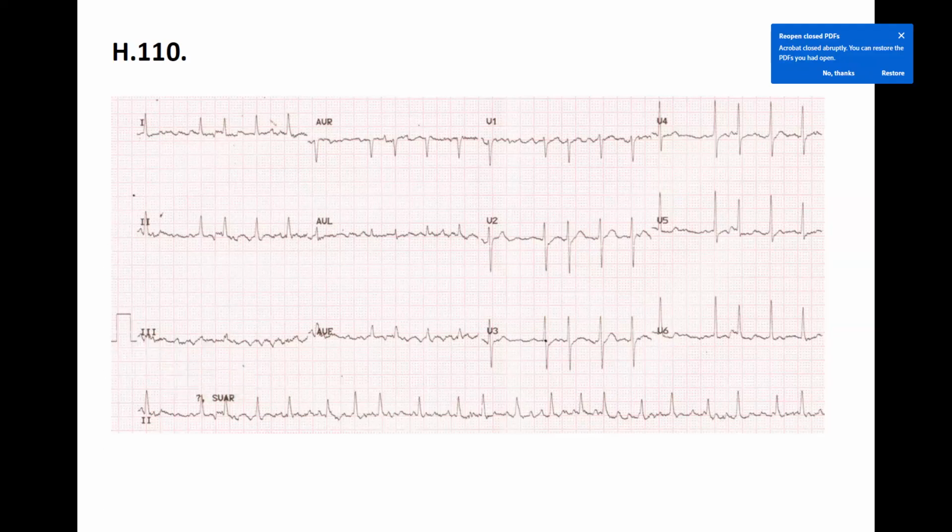Okay, so what we see here is an arrhythmic ECG. P waves are difficult to distinguish. There's either a lot of noise, but I think probably a little bit of atrial flutter because of the sawtooth pattern. If you are looking at, for example, this area, that could be the saw waves or flutter waves. But we have to get closer, first of all.